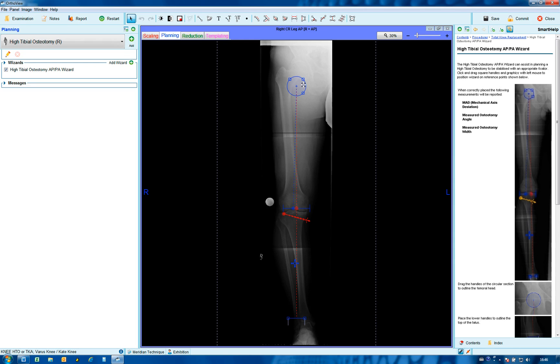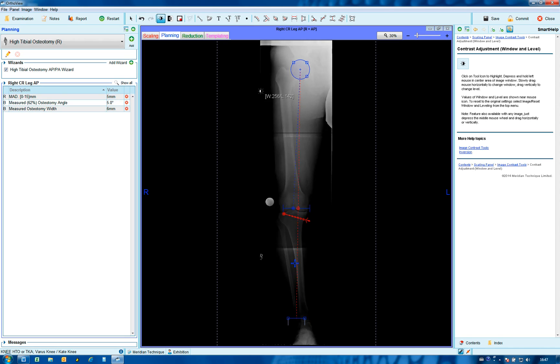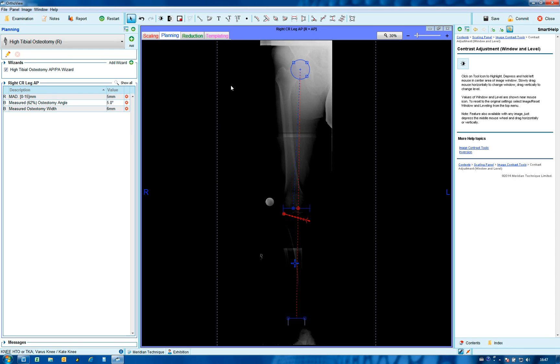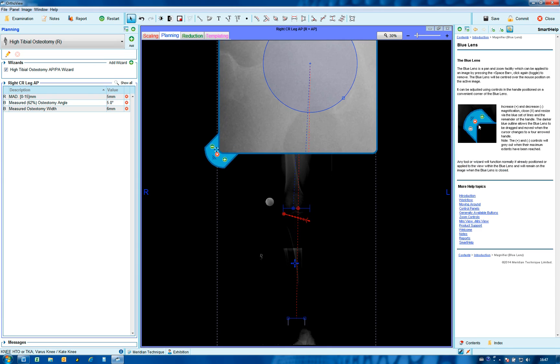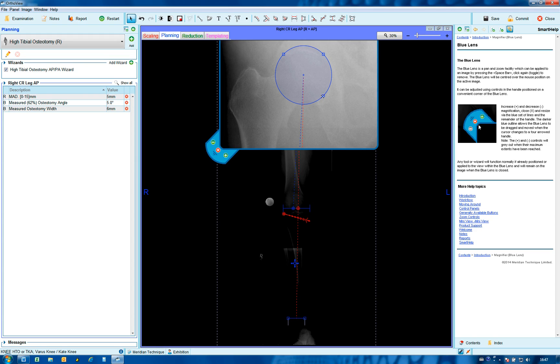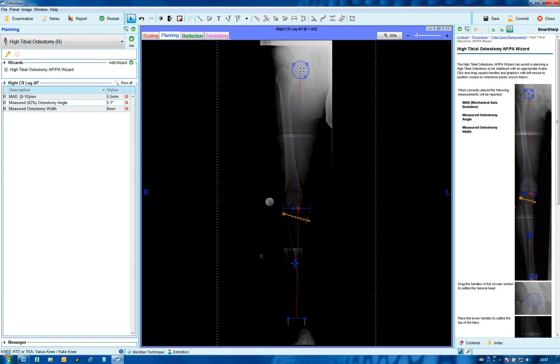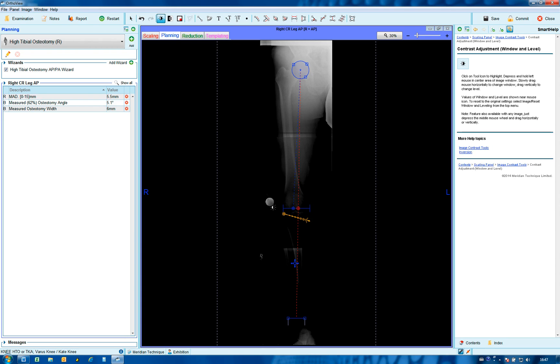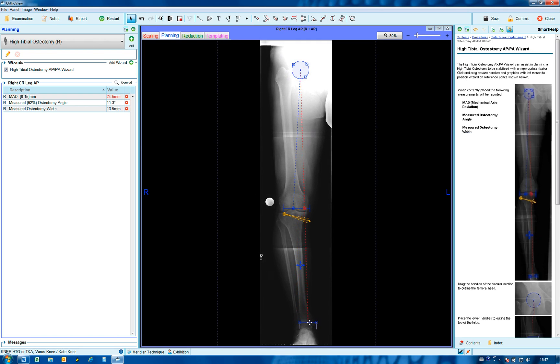Scale both images as needed in the usual way. Expand the long leg view and select the high tibial osteotomy wizard in the planning screen. Adjust the circle to the femoral head, altering contrast as needed, and use the blue magnifier to assist with viewing. Move the center to the femoral head and size as needed, adjusting contrast to suit.